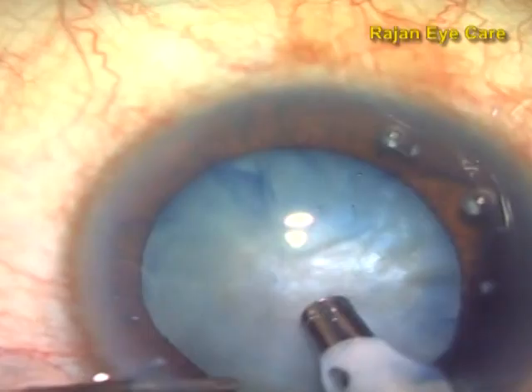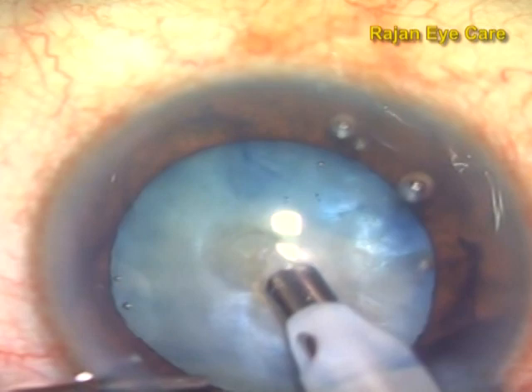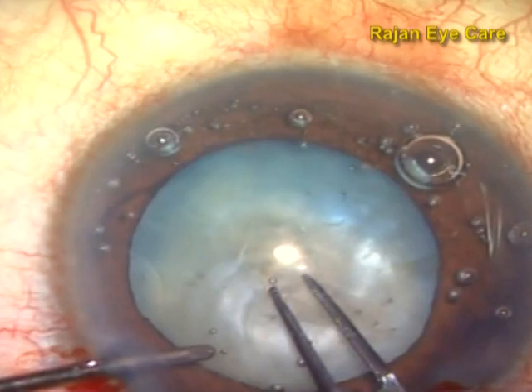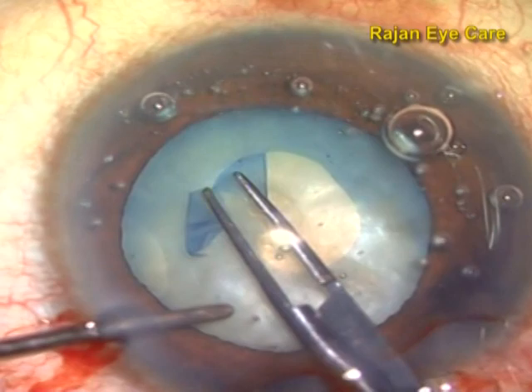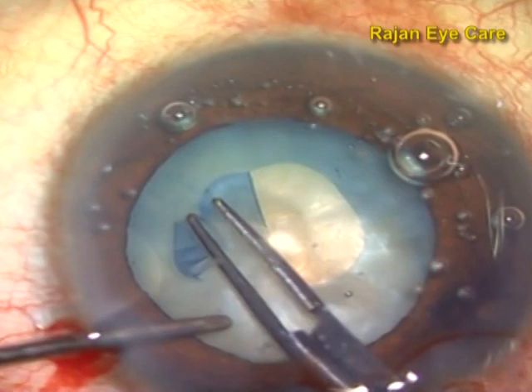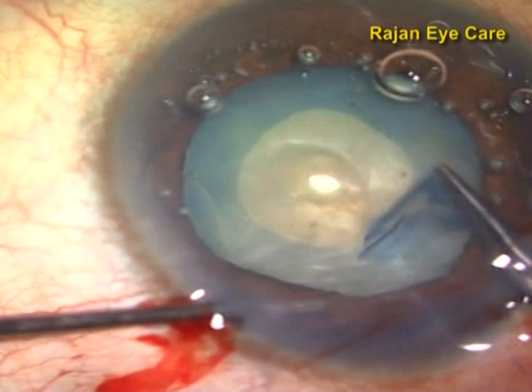In this video, you can see I am using a straight tip, 15 degree, bevel down, going into the center of the capsule, and then giving a punch. This technique is called punchorrhexis. Once you make a punch in the anterior capsule, there is a sudden decompression, and because of that, there is no tendency of the capsule to extend to the periphery, thereby preventing an Argentina flag sign.